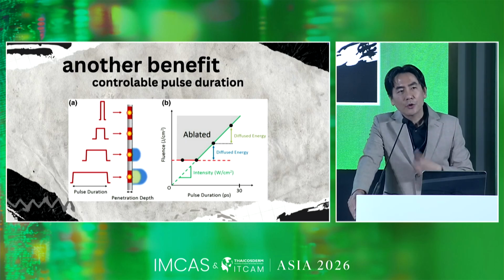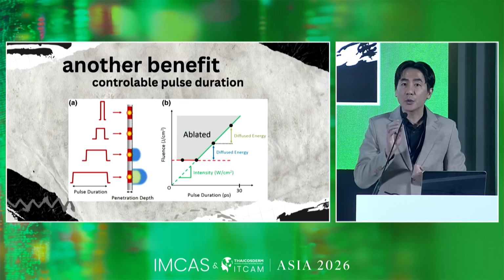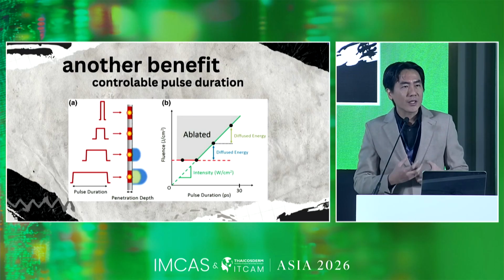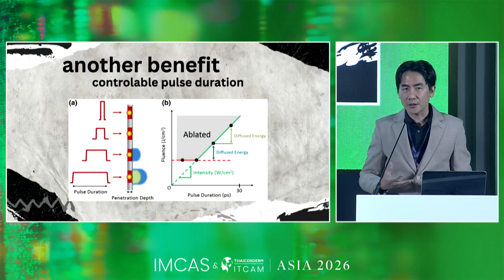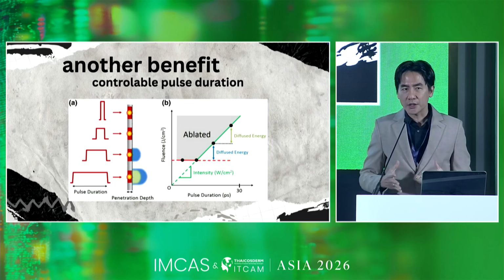First is photomechanical ablation, which means creating photomechanical destruction, just like when we use the PICOs, with laser-induced optical breakdown. Basically, we create a small vacuole, a small destruction in our cell. That's the photomechanical. The second way is photothermal stimulation.